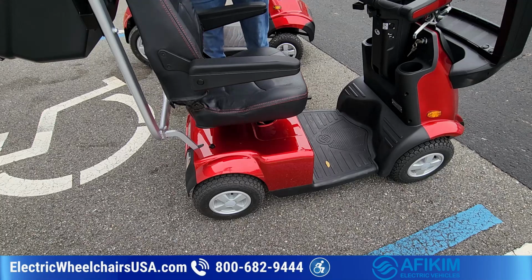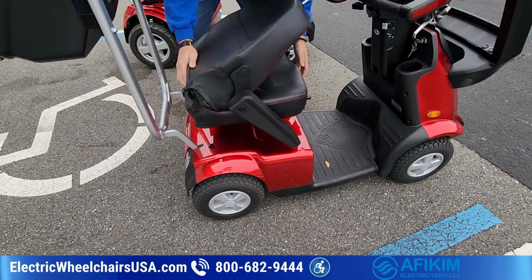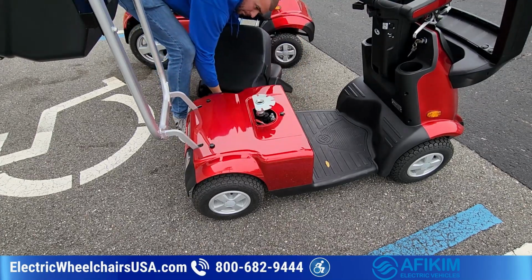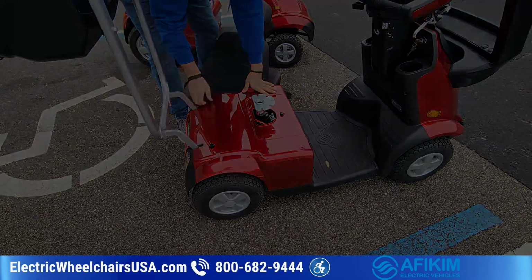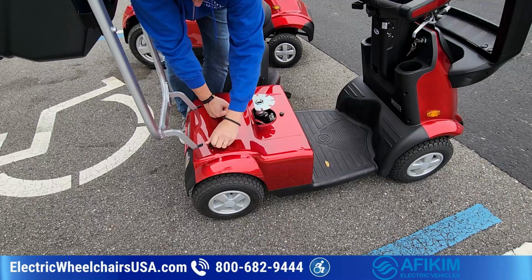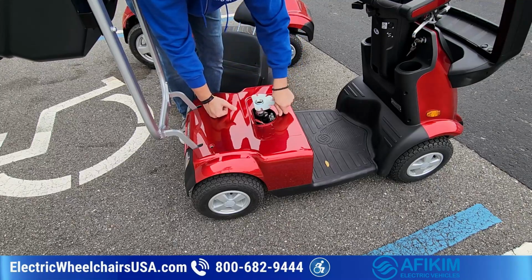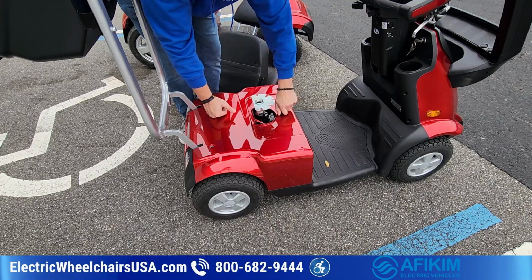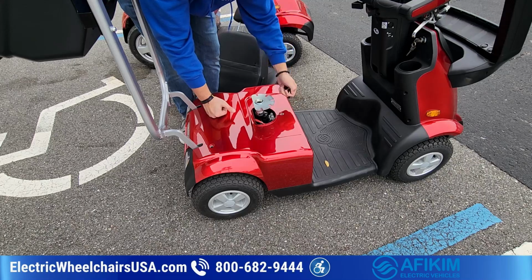So if I fold the seat down, like that, and I can pull the seat off, and I'll loosen these. Well, one of the common things that we get phone calls about when people are having issues is battery issues, because people don't take care of their batteries properly. And this is really going to be with any mobility scooter, not just Afikim.